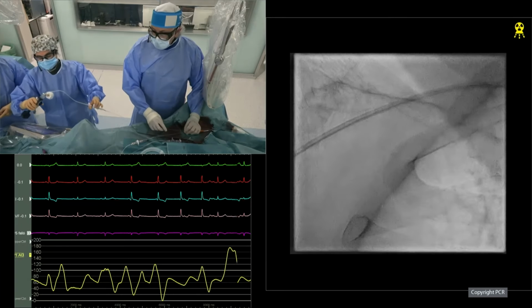You know, alternatively, what we can do is to perform a simple side opening, side pot. Side pod. Good. Okay. Give me a small test, Nieves. It's a bit more proximal.